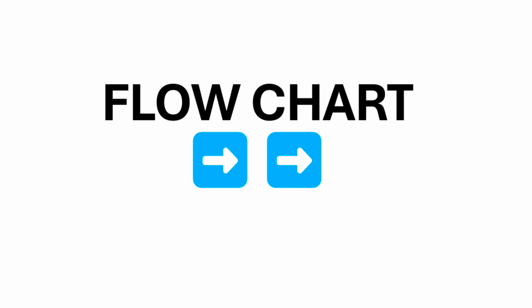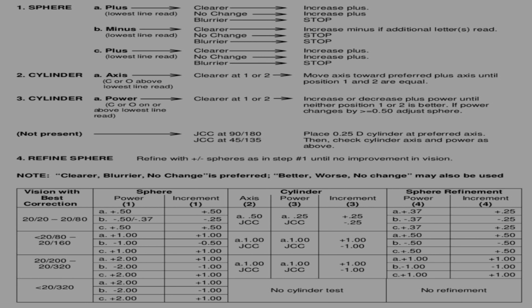And this is the flow chart. It contains a summary of the refraction protocol from the RVACC refraction testing procedure manual PDF. Full detail about the step-by-step procedure of refraction is given in a small flow chart. You can remember it easily. And that's all. Today we learned in full detail about the protocols of refraction and the step-by-step procedure of refraction.